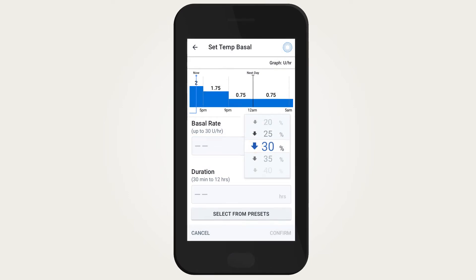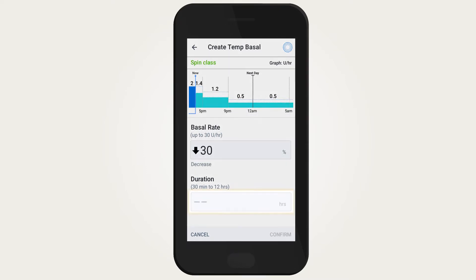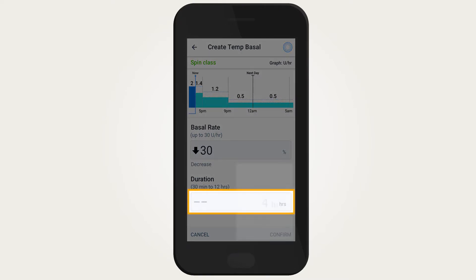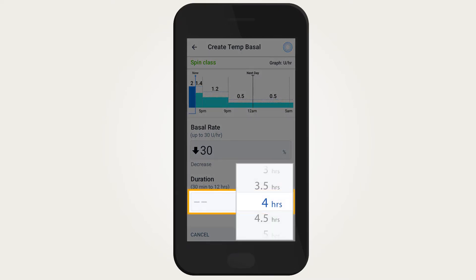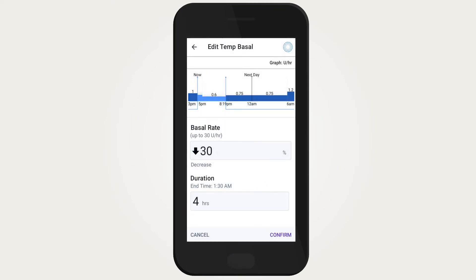Scroll up to choose an increase and down to choose a decrease in basal insulin delivery. Tap on the duration to choose the length of time you would like this temp basal to be active.